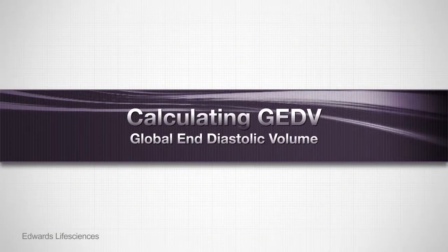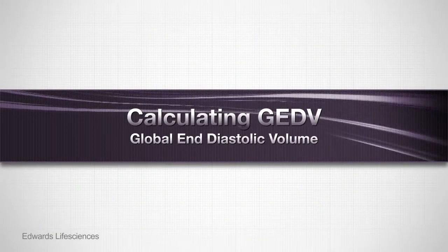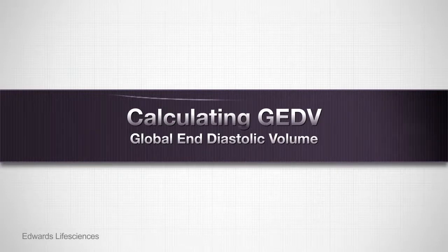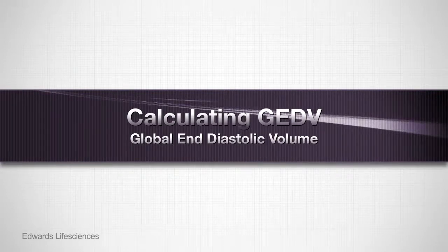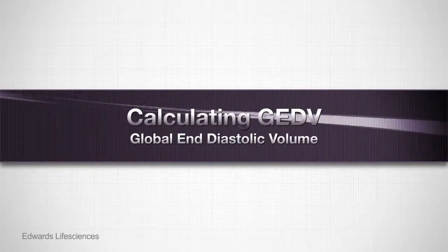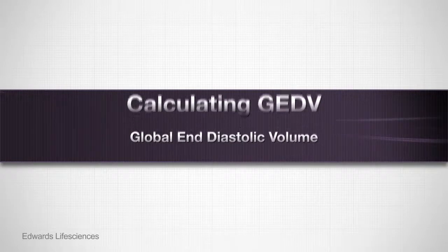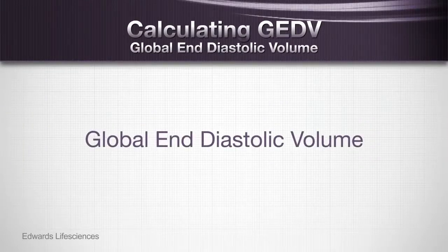The transpulmonary thermodilution measurement used to calculate cardiac output can also be used to calculate other physiologic parameters, such as global end diastolic volume, global ejection fraction, and extravascular lung water. These parameters are useful in evaluating and guiding volume resuscitation, ventricular performance, and changes in lung water that develops from disease or interventions. Let's first learn about global end diastolic volume.